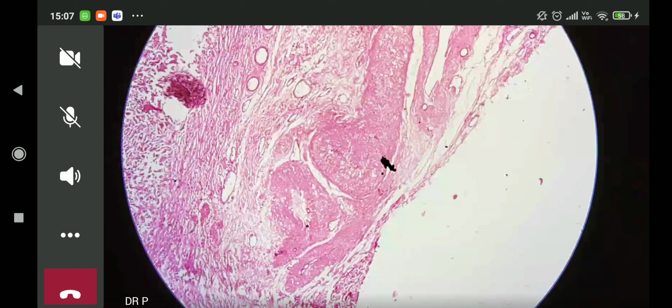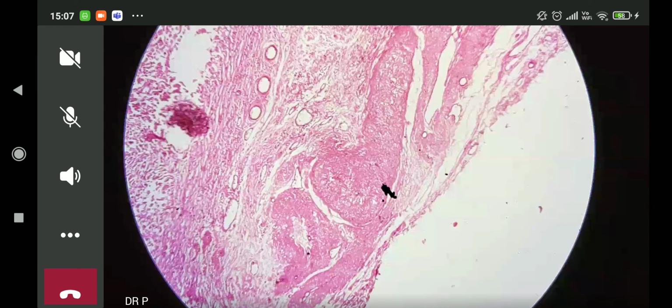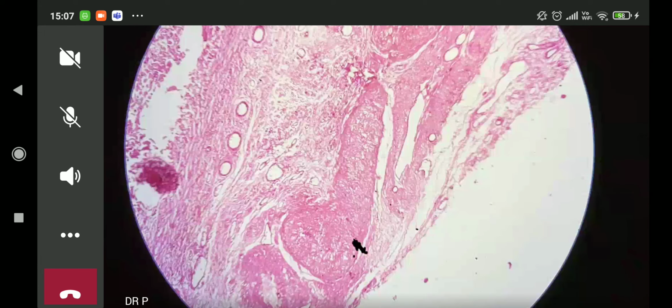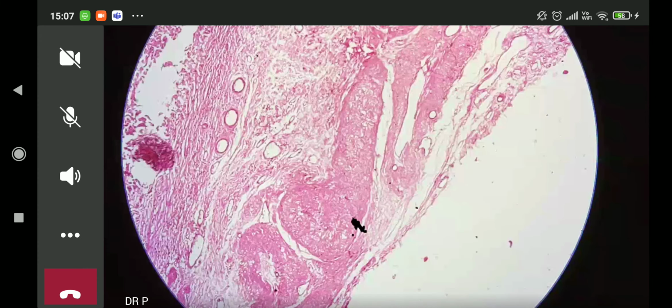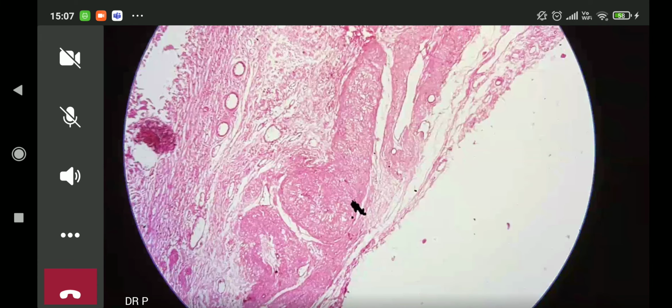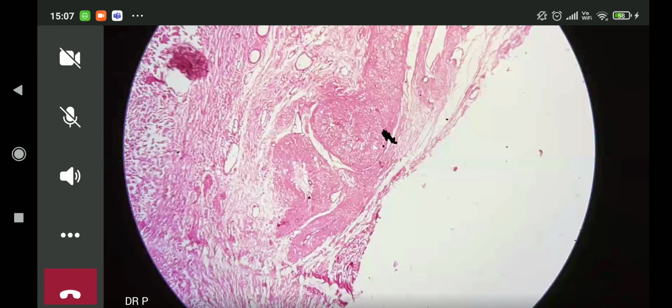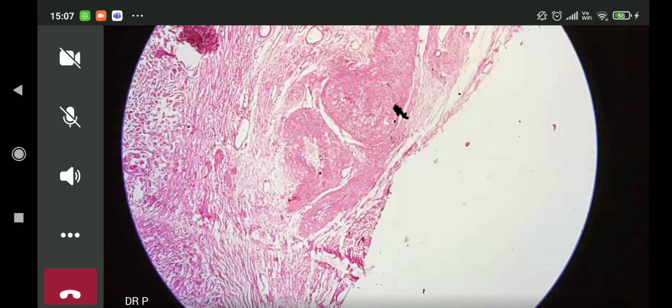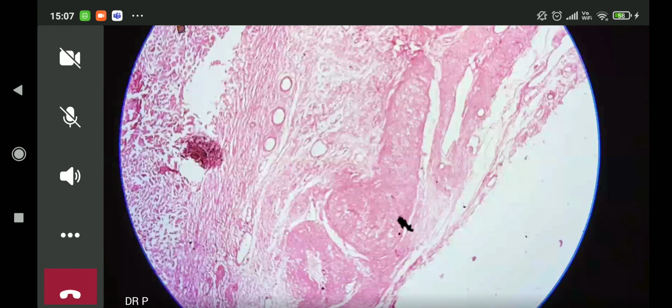Okay, so this is actually a thickened blood vessel, okay? This is a thickened blood vessel. You can barely see the intima. The media is all thickened. Look at this one. Here you can see a lumen. And then you can see a thickened media. So why would the wall of a blood vessel become all thick like this? You can see. So these are all larger arteries, but they're all thickened.